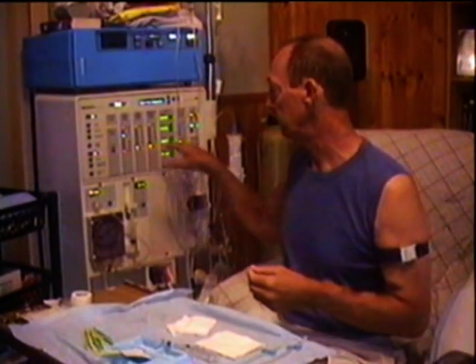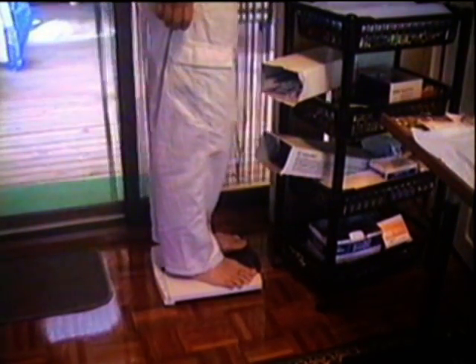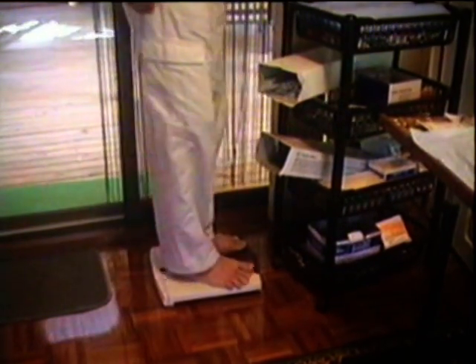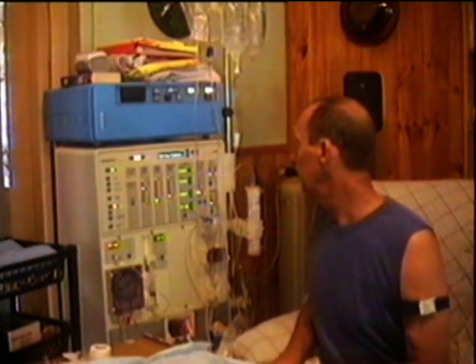Then I'll be on the machine for five hours. While I'm waiting I can also weigh myself, because you need to know your weight to put your fluid levels in. The scale says I'm 76.4 kilos. My dry weight is 75, so I have to take 1.4 litres off. Because I have a few drinks while I'm on the machine, plus what you use to wash your blood back, you have to add a litre — so all up it'll be 2.4 litres, which I'll dial into the machine.